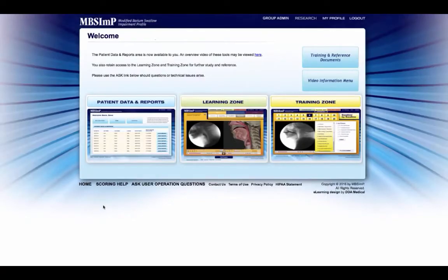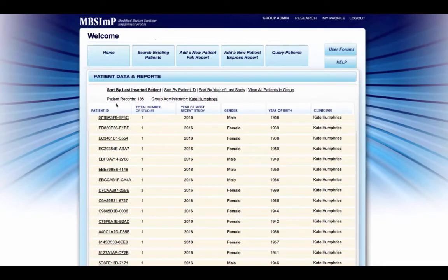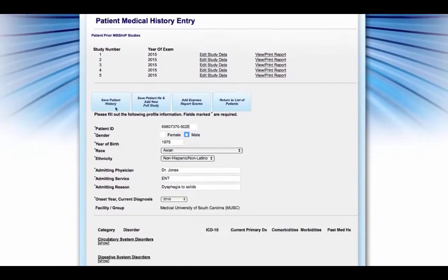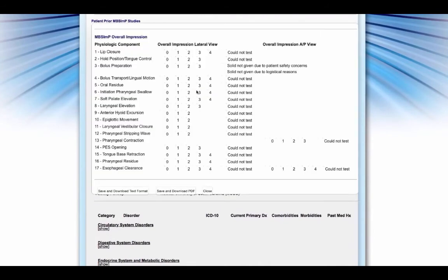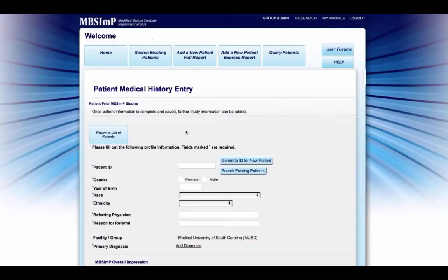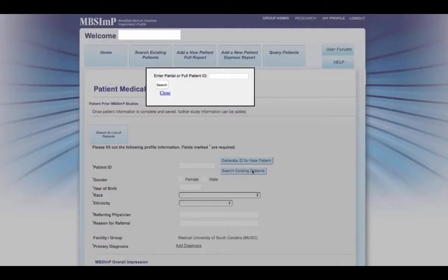The MBS-IMP website includes an express report feature that allows clinicians to quickly enter MBS-IMP scores into the database and produce an abbreviated report. To access the express report, click on the patient data and reports link on the home screen. Once you are redirected, scroll to the top of the patient record screen and locate the add a new patient express report link. In addition to the patient record screen, the express report link can be accessed through an existing patient's record. When accessed via the patient record screen, the express report feature provides the option to generate a new patient ID or search for an existing patient ID.